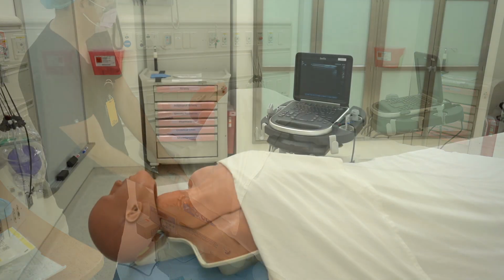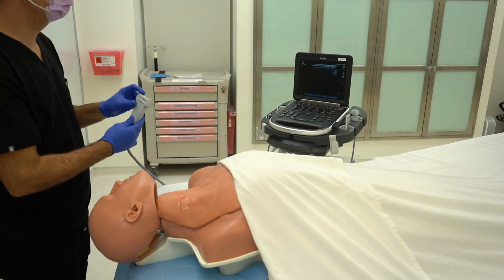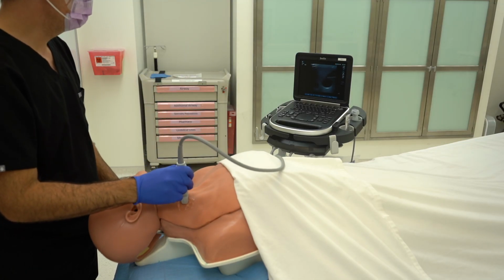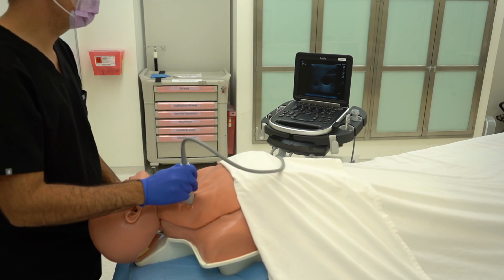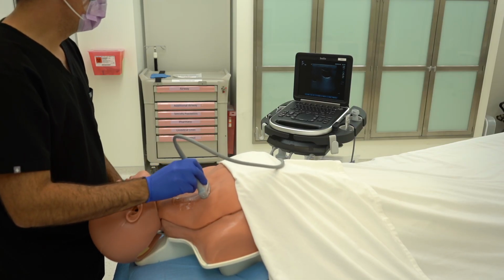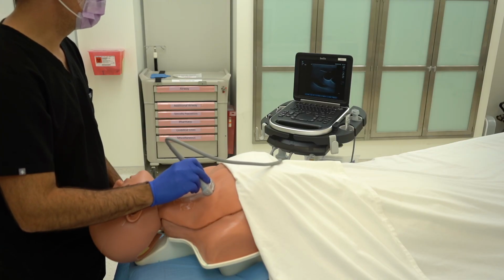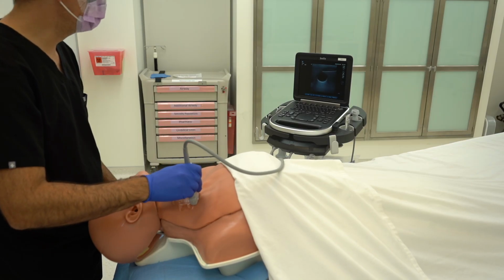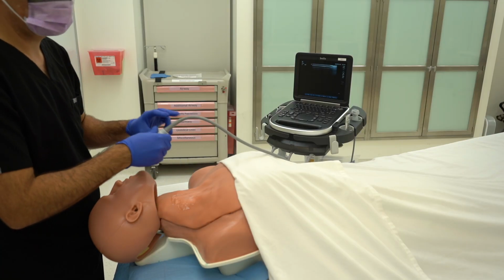We're next going to proceed to our ultrasound evaluation. Using a linear probe, going to assess the patency and direction of our internal jugular and corresponding carotid artery. We're essentially going to evaluate from the clavicle up to the jawline with gentle compression throughout to assure that patency exists. We're going to be evaluating for the IJ being lateral to our carotid. Evaluate, if we can, the carotid feeding into our subclavian artery. And once we have a good understanding of that, looking at the symmetry of the alternative side will be important as well.